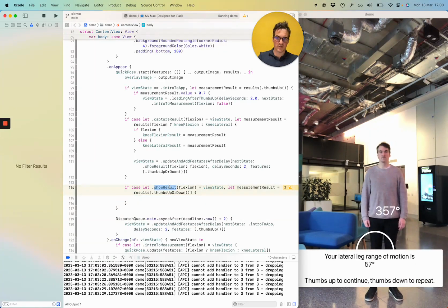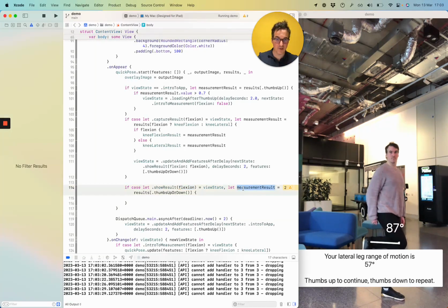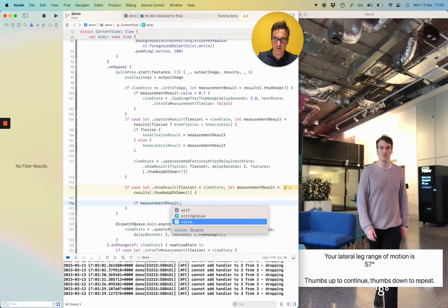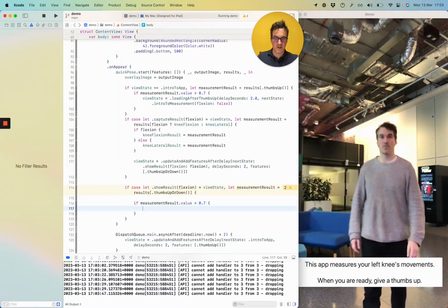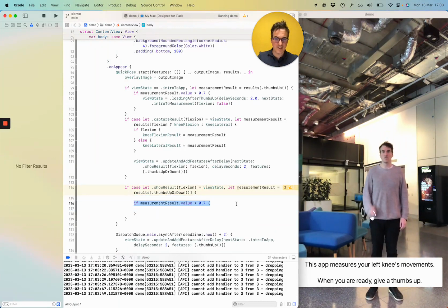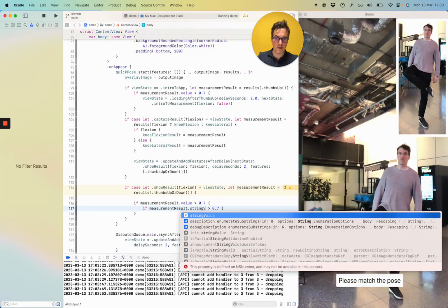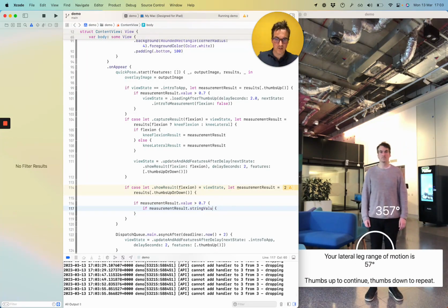Okay, so if we're getting a result and it's thumbs up or down, what logic do we want to happen? Well, firstly, we need some probabilities for the measurement result. So if the measurement result value is bigger than 0.7, so it's pretty confident in its decision. This has actually 2 states. So the string value can be thumbs up or thumbs down. So let's actually have a quick look at that before we fly into anything.